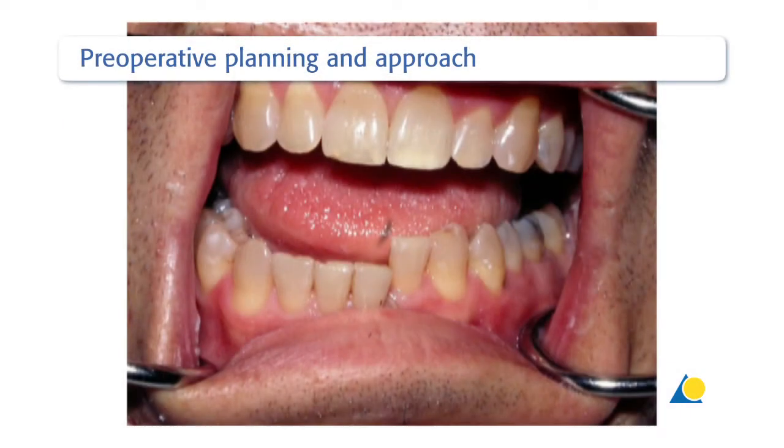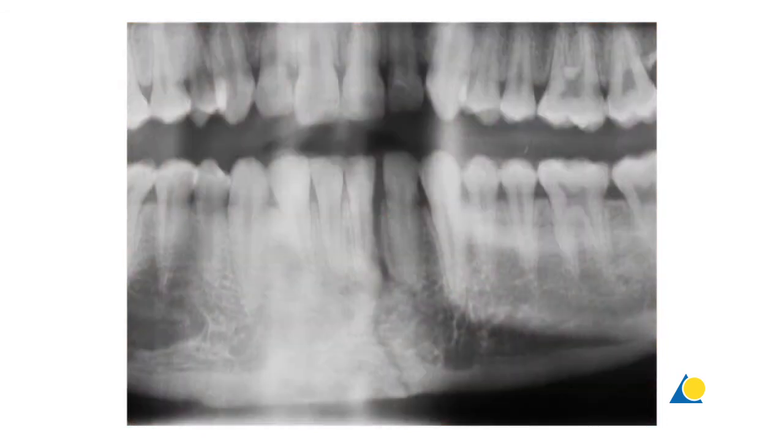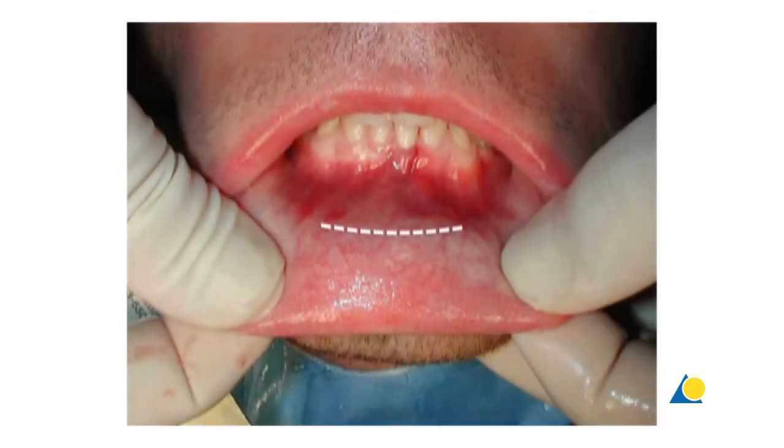Here is the clinical situation. Preoperative X-rays are needed in two planes, usually a panoramic and a PA view of the mandible. CT scans may also be used. The standard approach for fractures of the symphyseal region is intraoral.